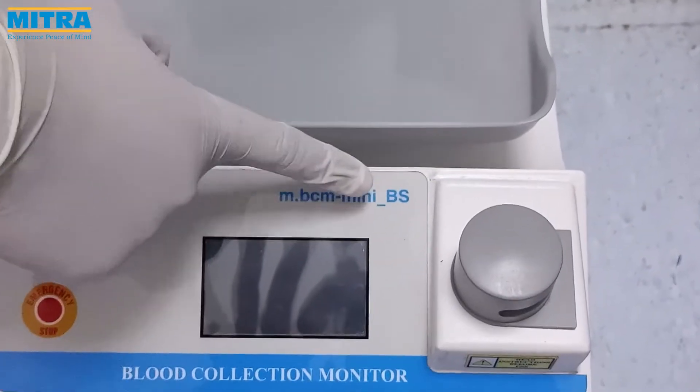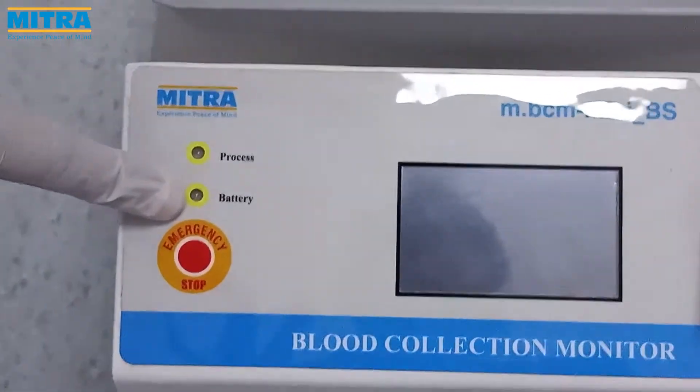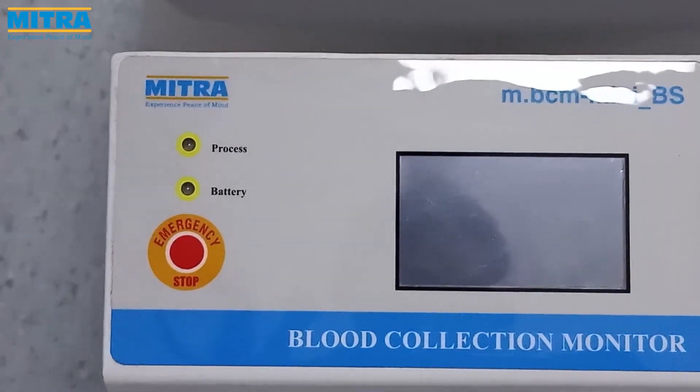The BS in the product name stands for battery supported. This is the multi-color battery indicator which shows the battery status — green color for full and red color when it needs to be charged.